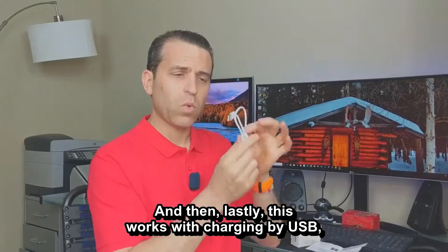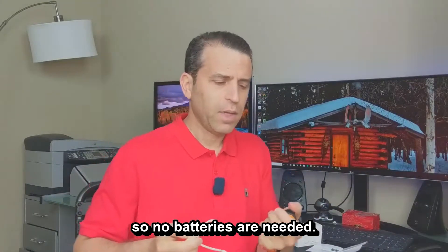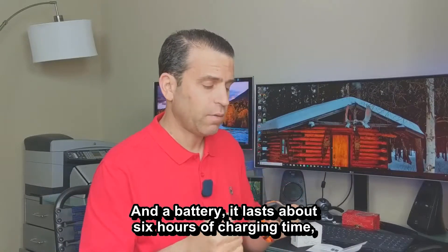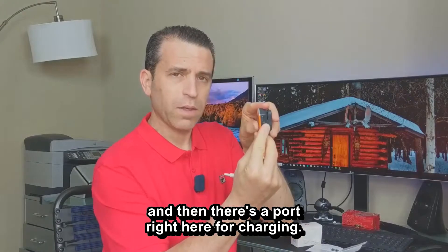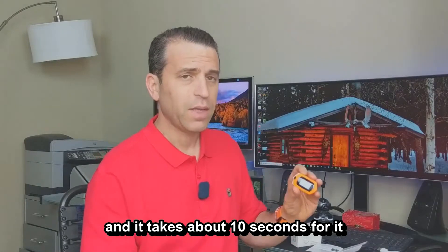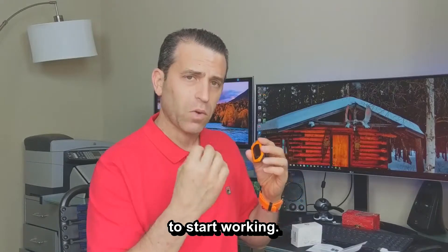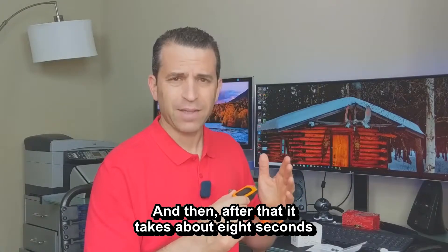Lastly, this works with USB charging, so no batteries are needed. The battery lasts about six hours on a charge, and there's a charging port right here. It's a very simple product — one button push to turn on, and it takes about 10 seconds to start working. After that, it takes about eight seconds to turn off.